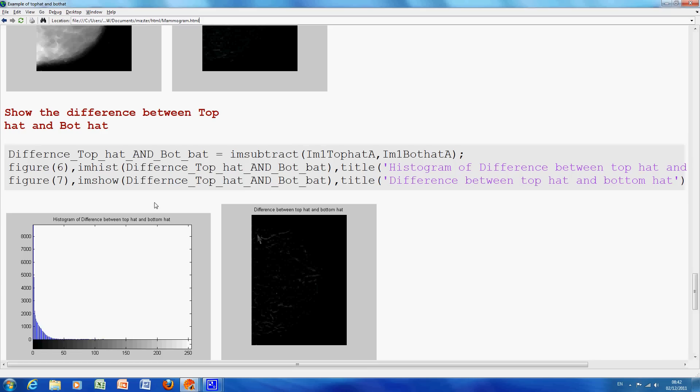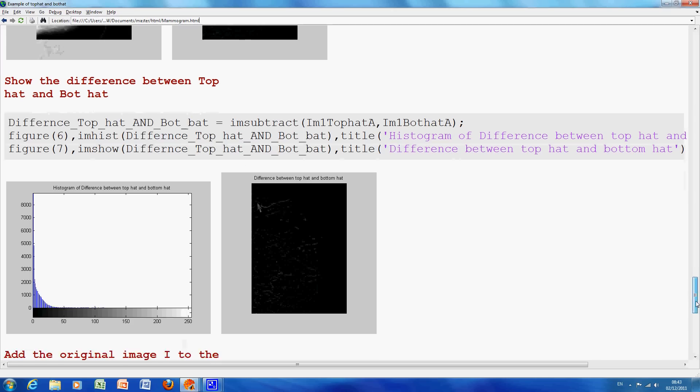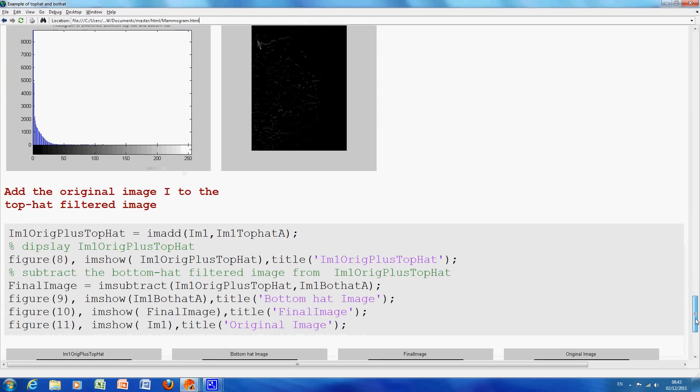So, not that this is part of the operation, but just what I did here was, I got the difference between the TopHat and the BotHat, but that's just really not relevant, but just to show you some histograms here.